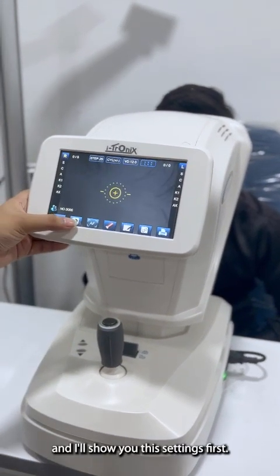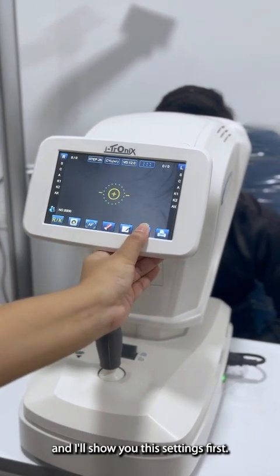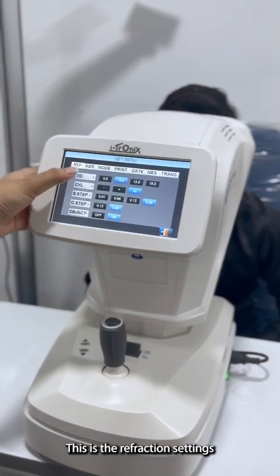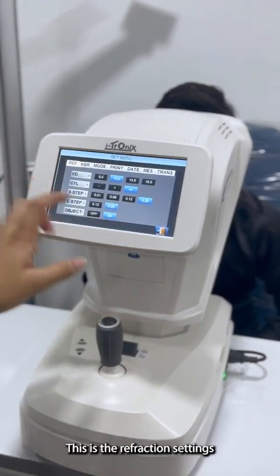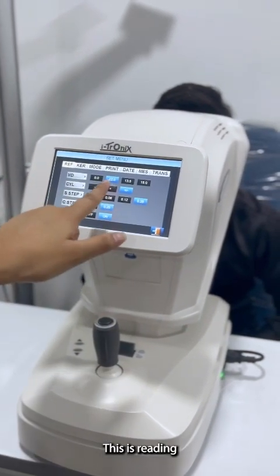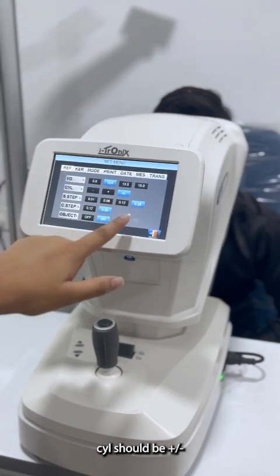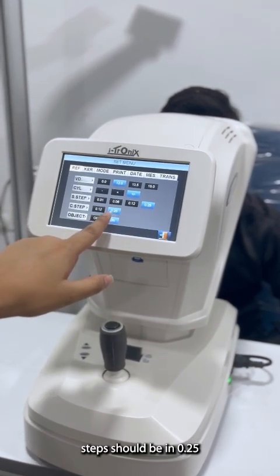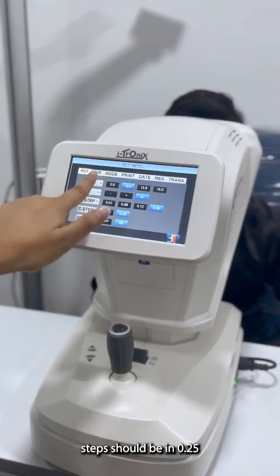I will show you the settings part. These are the refractor settings you can do. This is VD. Cylinder — it should be plus or minus. Step should always be 0.25, and it should be on.